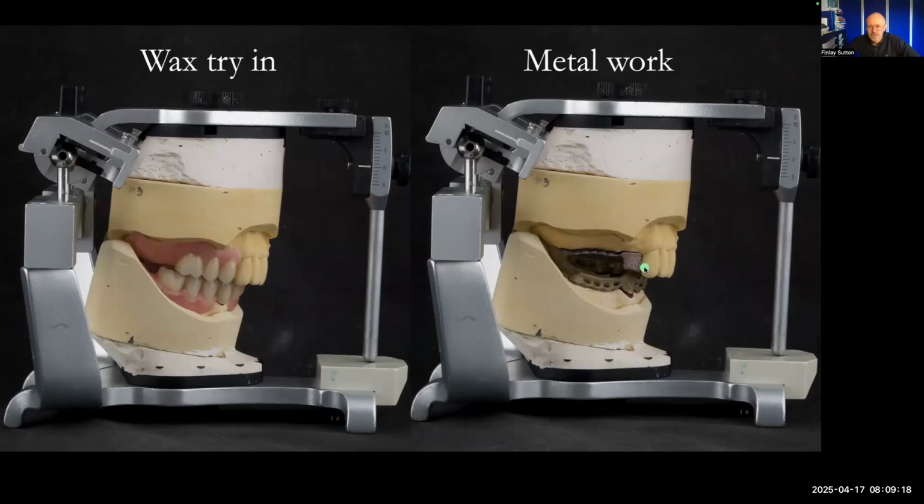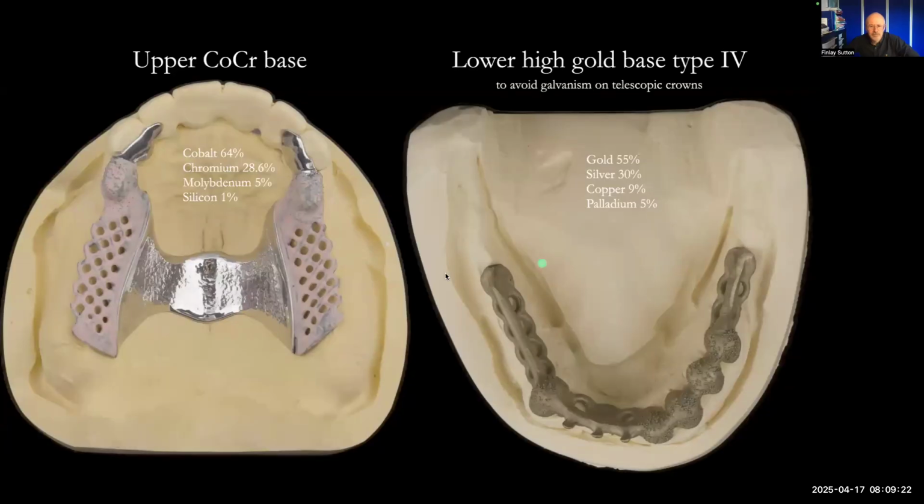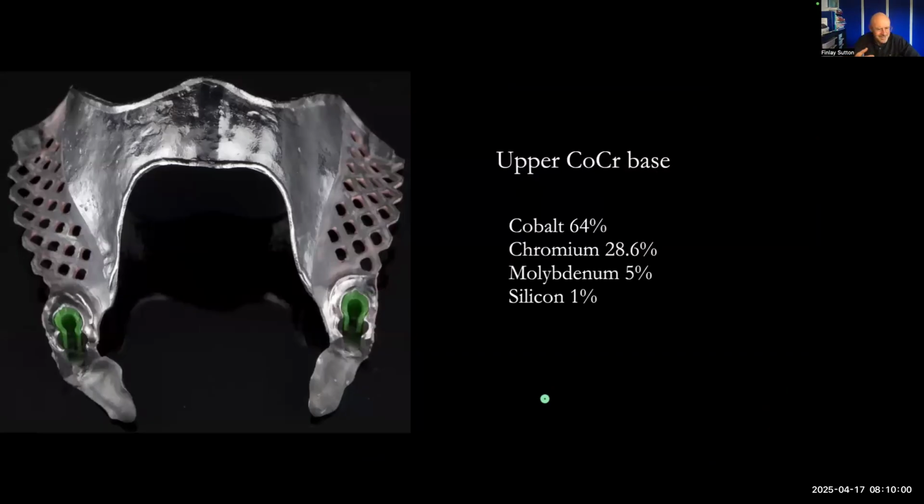So, let's just have a look here. So these are the metal frameworks. So in the upper, I was using chrome cobalt, and that's the alloy that we use, which is actually called Wiranite by Bego. And then in the lower, because we've got these gold copings, I wanted to use a high gold content base, but hard, which then fits over it, which has got these nice little beads to allow the acrylic work to really bond onto that. But I didn't want to have galvanism between the two metals touching there, and this sort of metallic taste and battery setup. So this is the upper chrome, and I just want to make sure it's fitting straight away.